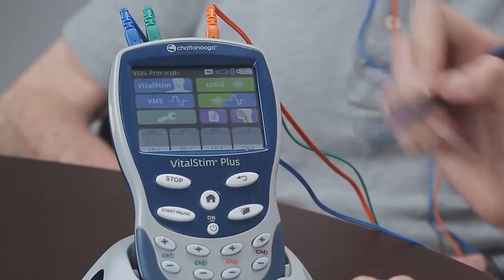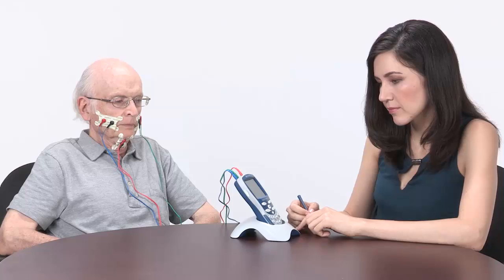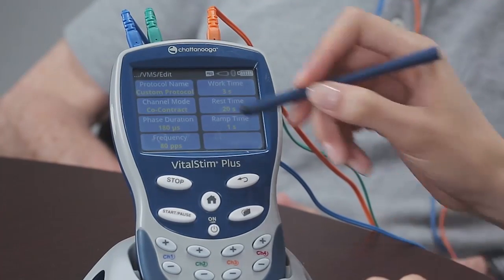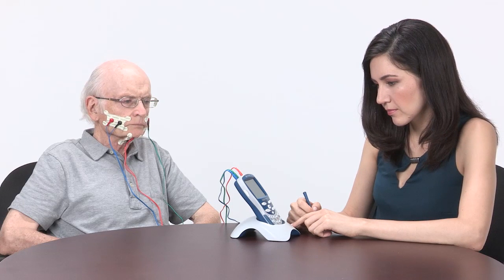Now let's show a variation on this approach. Let's go back to the home screen and again select VMS. Any protocol from there can be selected, and again let's select the gears icon. This will allow us to change the channel mode to reciprocal. In this mode, we can now introduce a sequence to the stimulation.